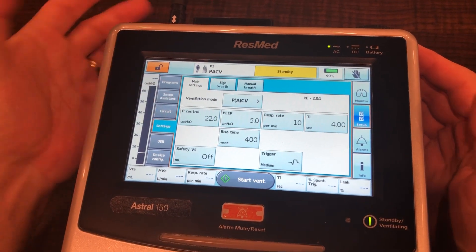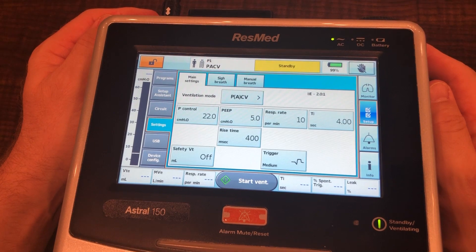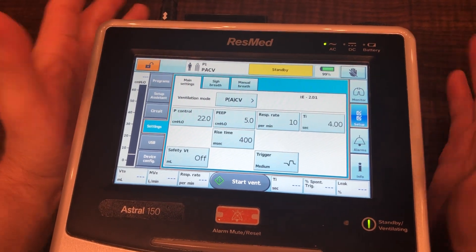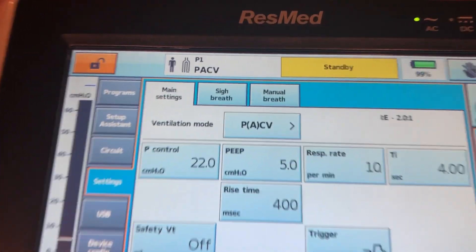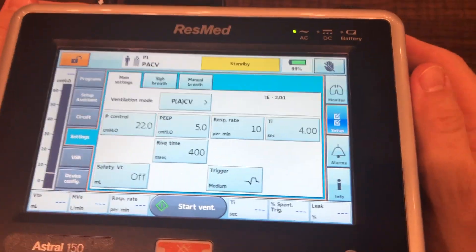That's the mode we're in. We've got our pressure control set at 22, our PEEP is at 5, our respiratory rate is at 10, and our I-time is at 4 seconds. If you'll notice right here we've got our I:E and it is 2.02:1, so we are truly inverted at this point.